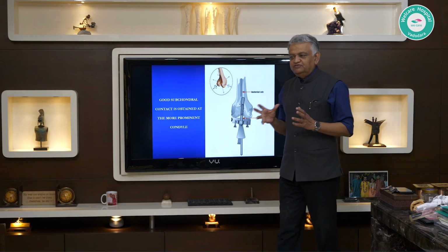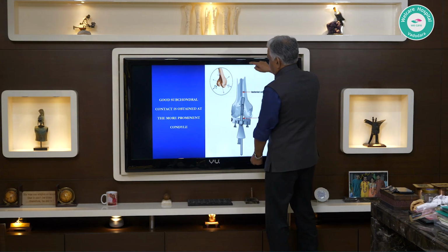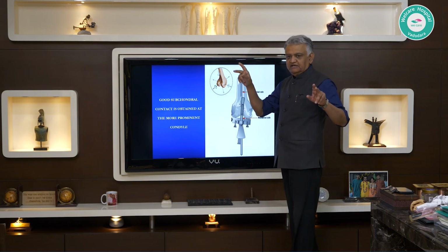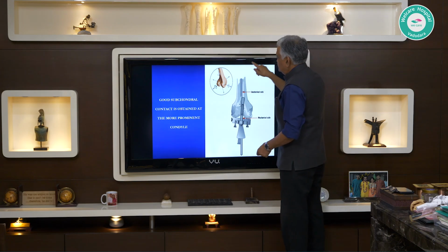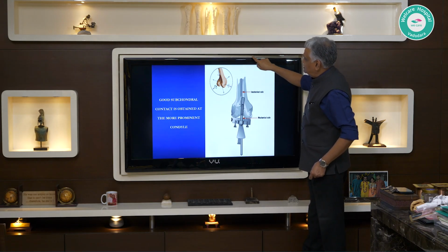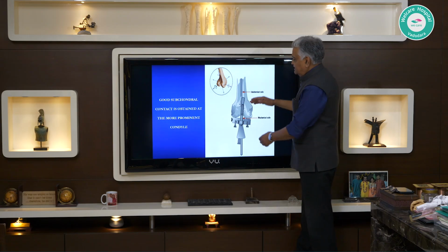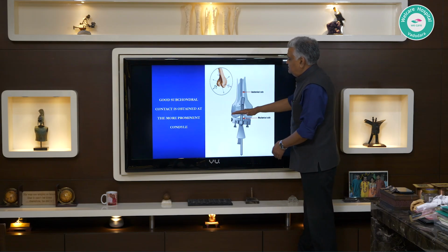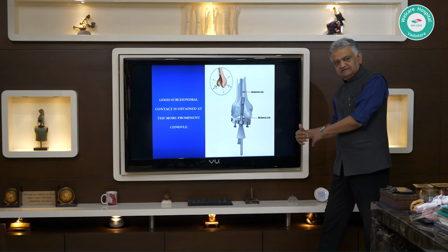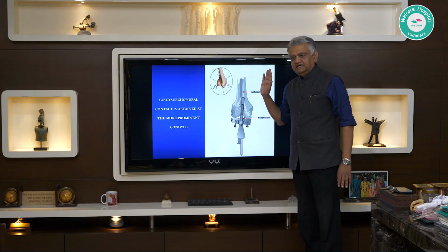The system of instruments designed with the help of navigation, navigation as a surgeon, can see the center of the head of the femur, center of the knee and the ankle, and then having seen it, it will very quickly, without needing to work from the anatomical axis, just say कि नहीं ऐसे रखना तो आपका कट 90 आ जाएगा मैकेनिकल को, समझे?